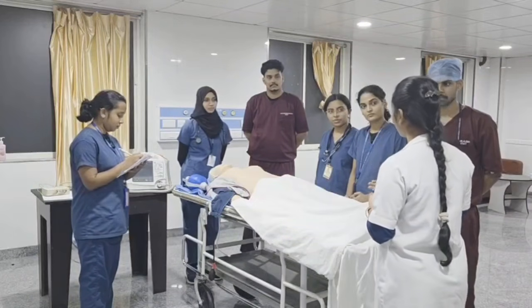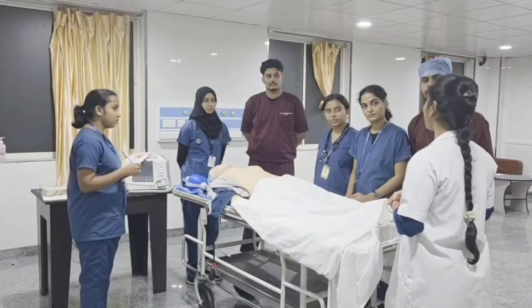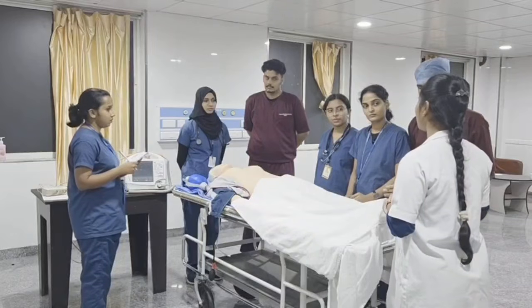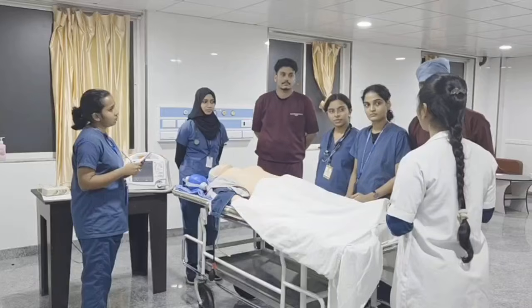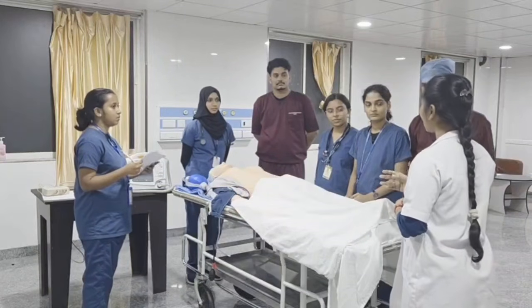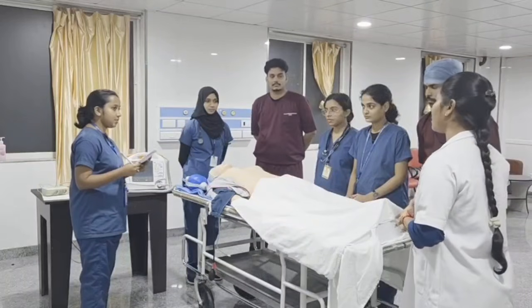Raisa, you can take care of the airway. Anand, you can take care of the compressions, ensuring that we provide high quality CPR and also use the feedback device. Ashwini, you can take care of the IV and medications. Nandini, you can take care of the timer. Akash, you can take care of the cardiac monitor, and also you are supposed to act as a CPR coach. Can we begin, ma'am? Yes.